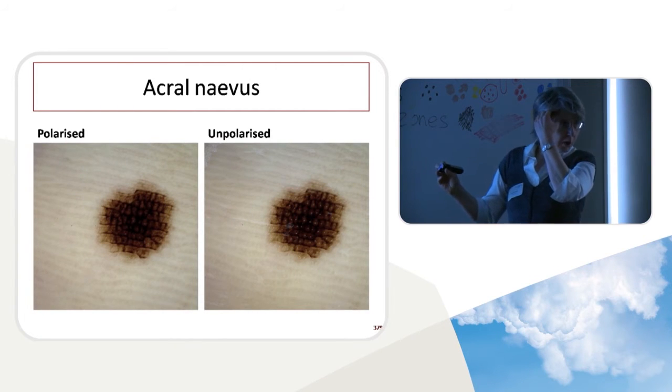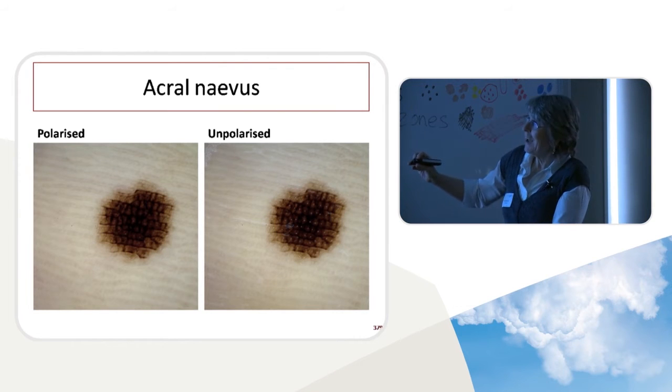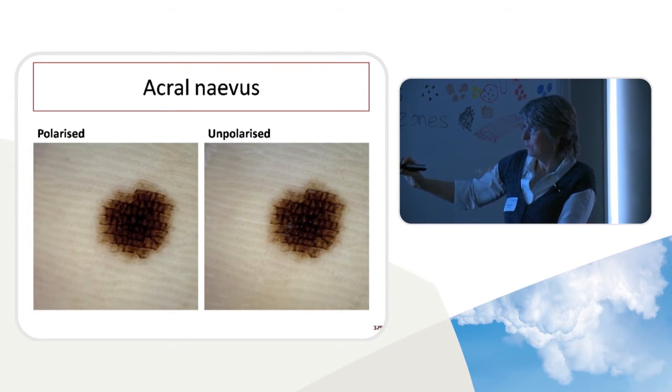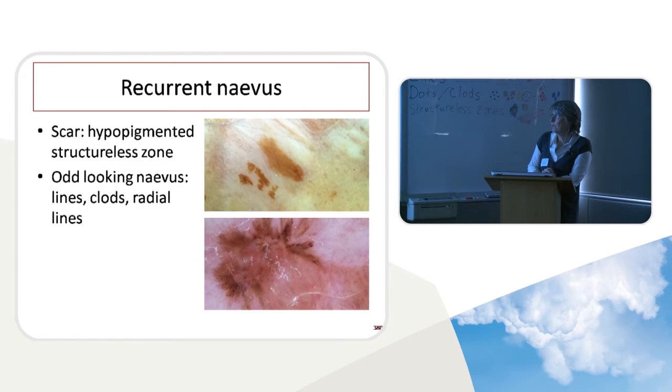But sometimes you can't see those furrows and ridges, and it's very helpful to be able to find the white dots due to the sweat dots. And here's an example where switching from polarized to unpolarized can make it much easier. Suddenly those dots show up nicely. So that's one example.